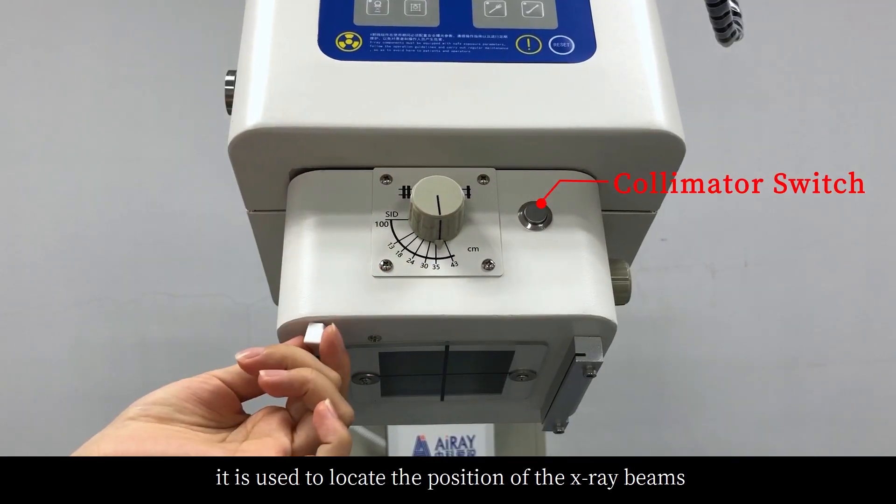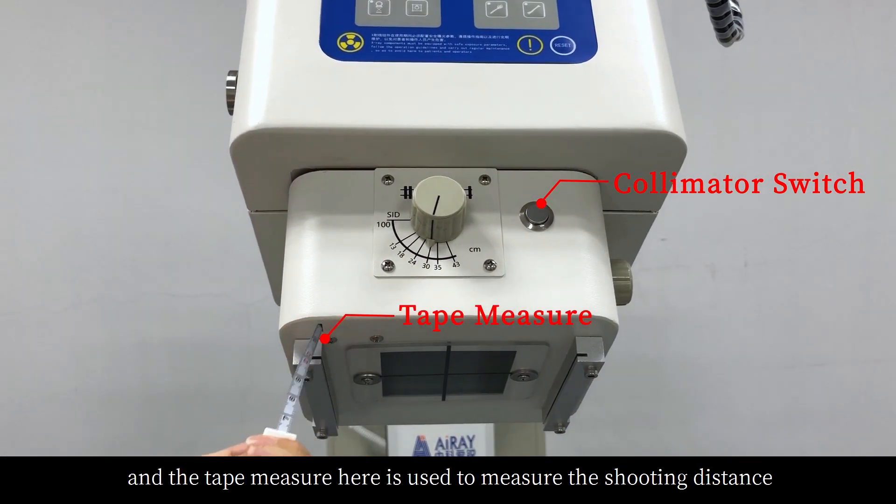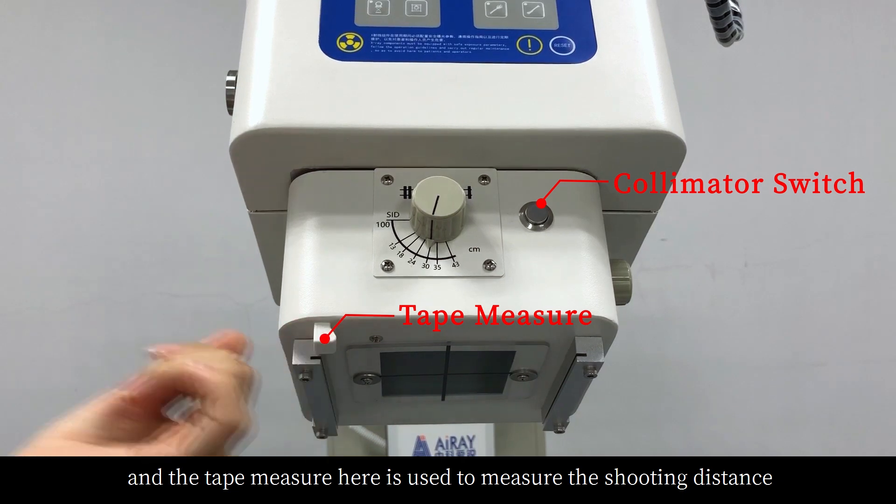This is the collimator. It is used to locate the position of the X-ray beams. And the tape measure here is used to measure the shooting distance.